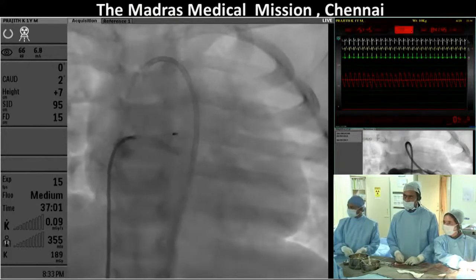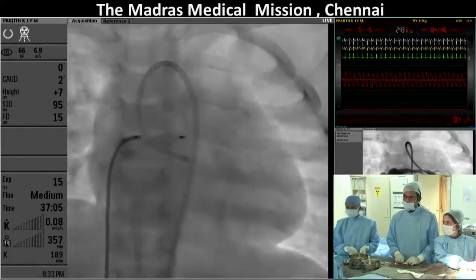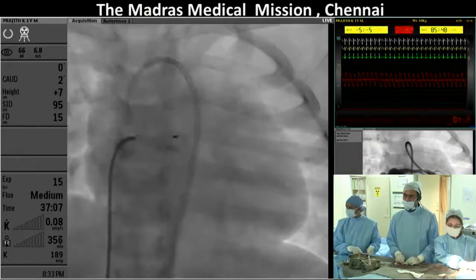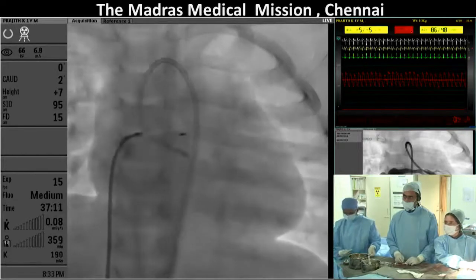So your plug is a little bit into the aneurysm, isn't it? And the other bit is in the dilated feeding vessel. Yeah, so now I am advancing a coil here. You might want to pull that retrograde catheter back.